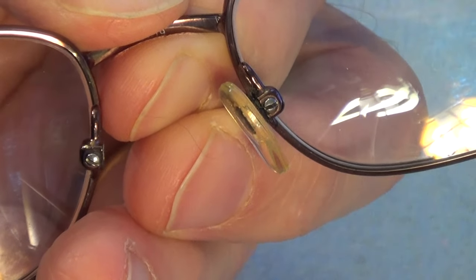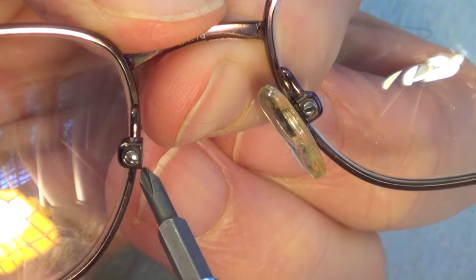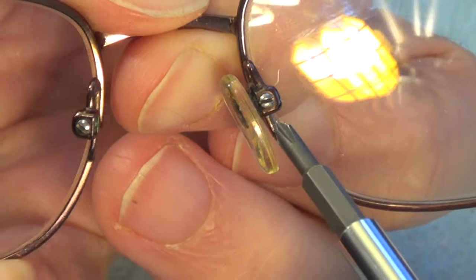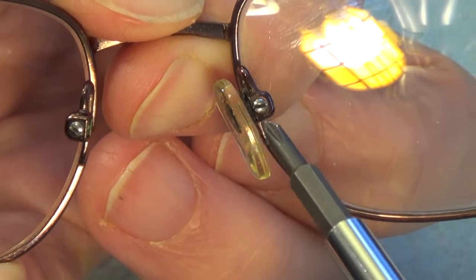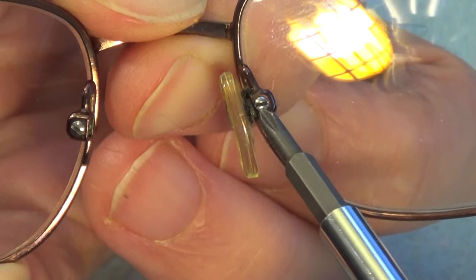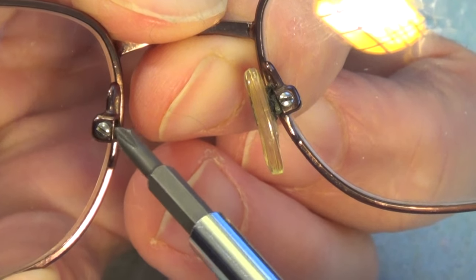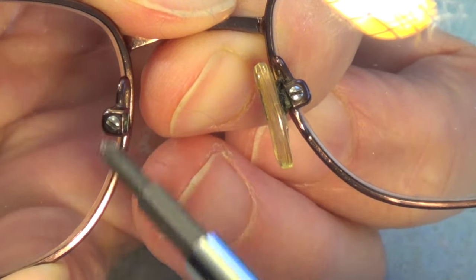Looking at the glasses, on the side where the pad fell off you can see a screw right here that we'll need to remove. On the other side there's also a screw. When you remove the screw, you'll see a little ring attached to the nose pad — it's that screw that holds the nose pad in place. Because the ring on the nose pad broke off, the screw can no longer hold the nose pad in place.